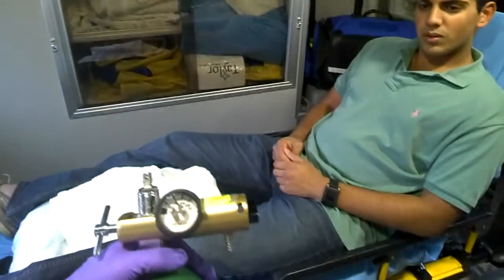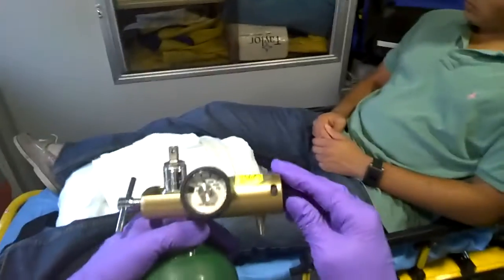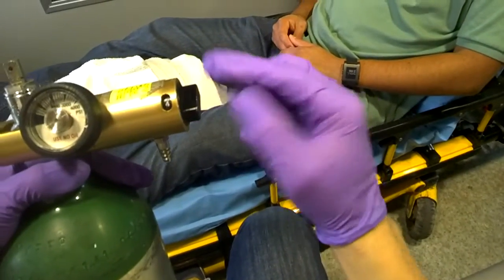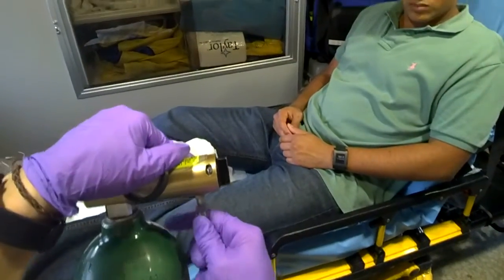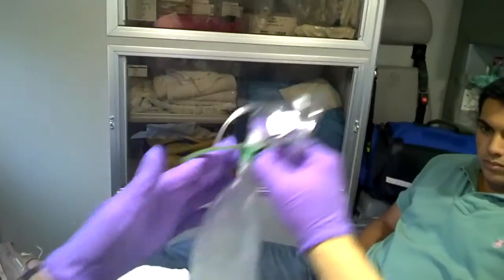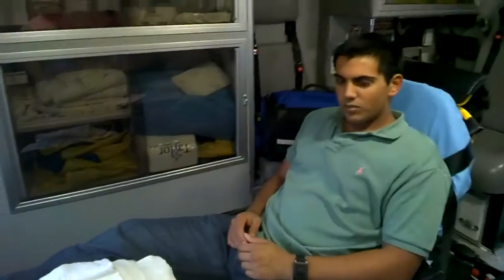So first thing is you want to choose how much oxygen is coming out for that specific oxygen therapy. So for the Non-Rebreather, we're going to set it at 15. And you can see the numbers right here that matches up with the flow rate. And then you want to attach the oxygen tubing to the end. And as you can see here, that is flowing. Now you want to fill up the bag so it gets full. And once it gets full, I'm just going to turn this off for now.